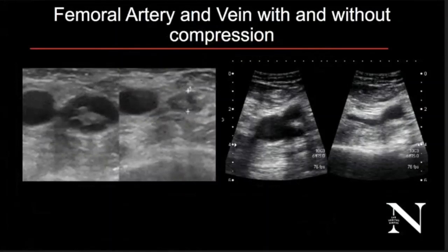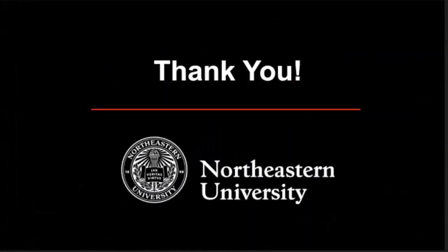So both of these sides have compression, non-compression, compression, non-compression. Which one of these has a normal femoral vein and which one doesn't? It's a little bit harder. Yeah. So left is compressible. Now this image is flipped, but this is the vein and it's not compressible, and there is a clot in there. Okay? So that's it. Any questions, let me know when we're doing the actual study.